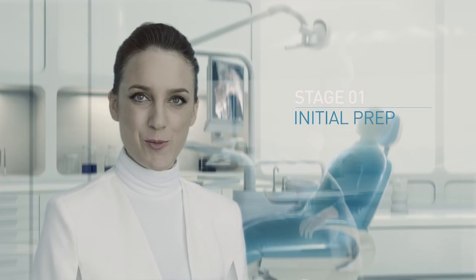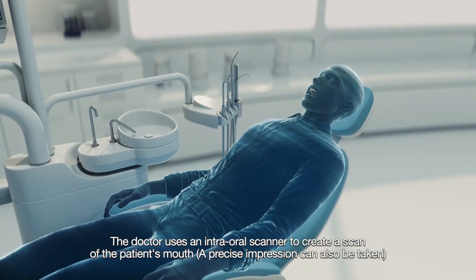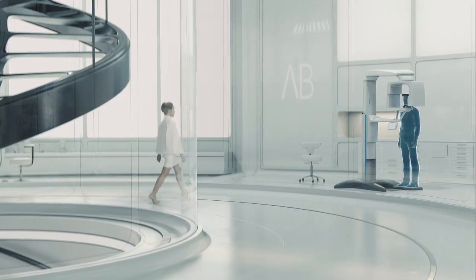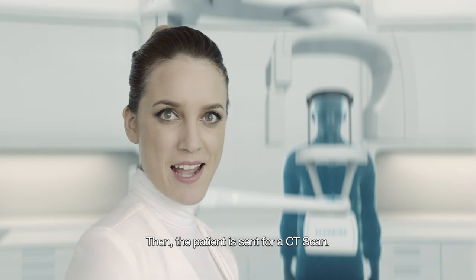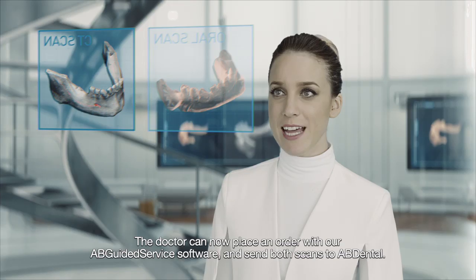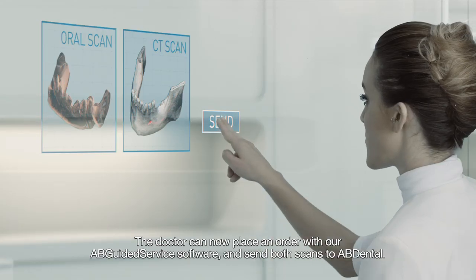Stage 1 – Initial Prep. The doctor uses an intraoral scanner to create a scan of the patient's mouth. Then the patient is sent for a CT scan. The doctor can now place an order with our AB Guided Service software and send both scans to AB Dental.